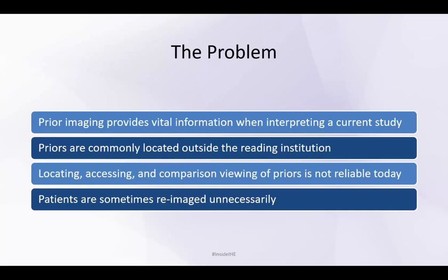But again, you find the same issue in many other instances, mainly in emergencies when you need to have access to a previous study, and you have to wait or try to use a web interface. This is slow.